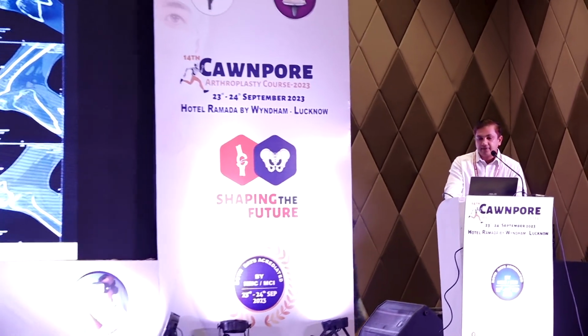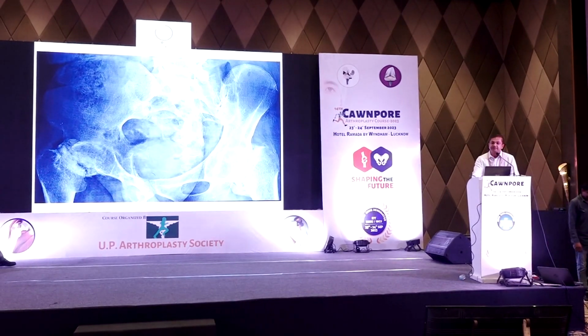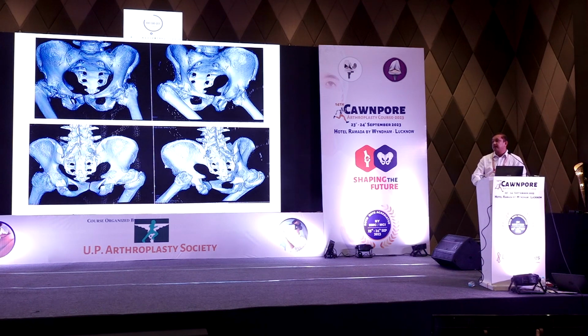Now the x-rays. This is x-ray of his hip, a bilateral knee, AP. The lateral view, almost. This is the CT scan of the knee. And this is his hip, both hips fused with the stress fracture. You were saying fused because it's radiologically fused, it's not radiologically ankylosed. So radiologically, we have the CT also. So it is fused. You can see that posteriorly it is continuously fused. There is a stress fracture also.